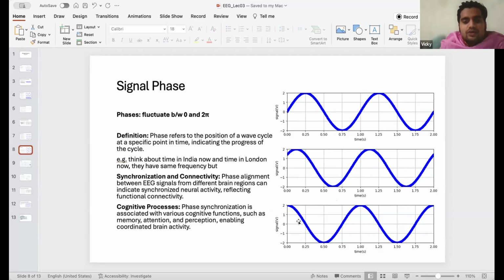And then why are we counting the peak at the top? It can be the peak like what it is showing in the third one, at 0.5. That is also a peak. If we just take 0 to 1 second, there is one peak, but it is downside, in the negative part. Amplitude you can take as an absolute value. What is the maximum value?